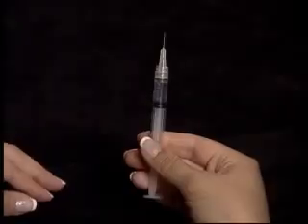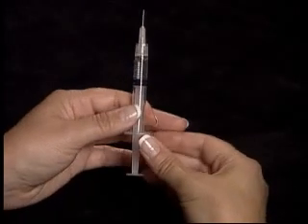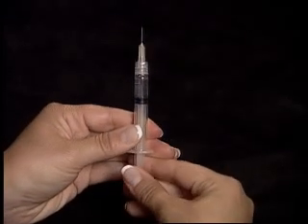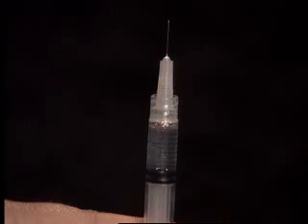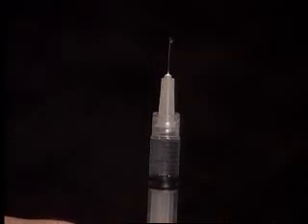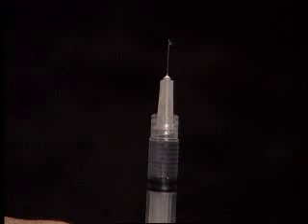Hold the syringe with the needle pointing up, tap the syringe to force any bubbles to rise to the top, and gently press on the plunger to expel the air. Based on your medication, please understand that your needle and syringe may differ from the one used in this video.